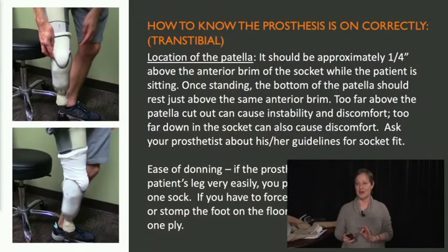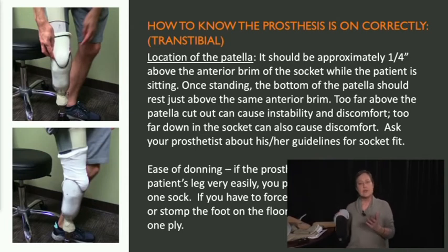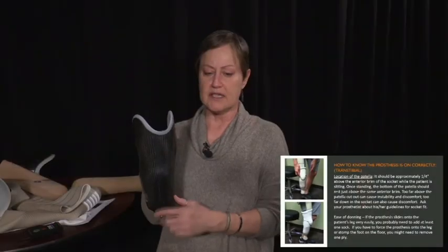How to know if the prosthesis is on correctly. I find this to be really helpful for us as therapists. It took me years to learn this, so I want you to know it right now. Where the patella is, this is specifically for trans-tib patients. This is the way our prosthetists make these legs. You again want to double check with your local practitioner.